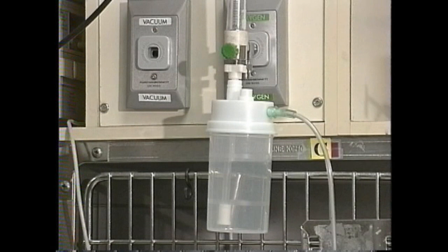This is a humidification chamber — you can buy these in boxes of six from several different companies. Baxter and Abbott sell these; they're made for single use but they'll last a very long time. Note at the top of the base of the container there's a little protrusion — that's a pop-off valve wherein if the system over-pressures it should chirp, buzz, or make some other audible alarm noise.